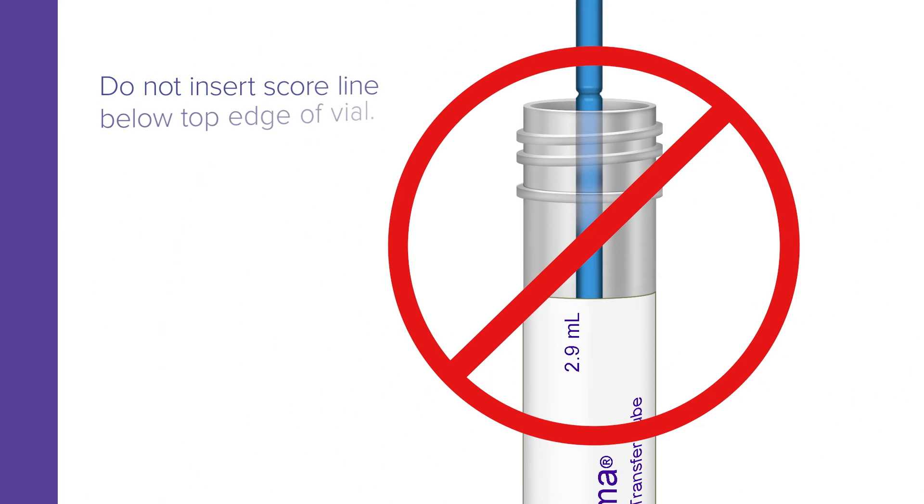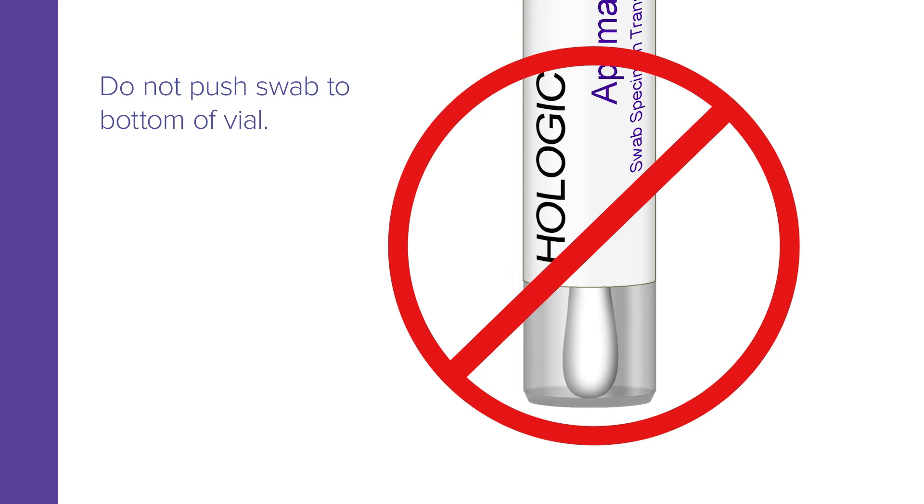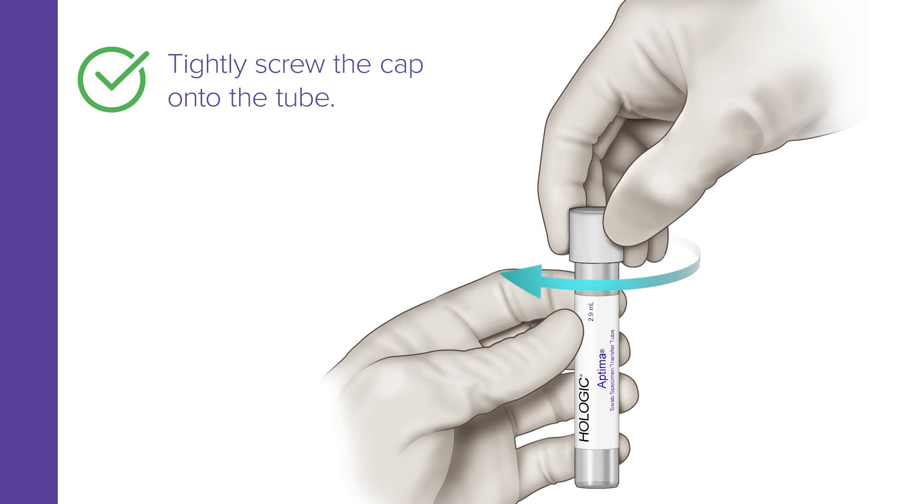Do not insert the score line below the top edge of the vial, and do not push the swab to the bottom of the vial. Now, tightly screw the cap onto the tube.